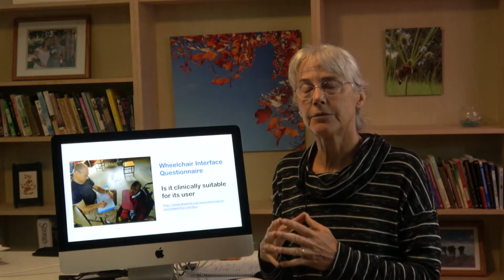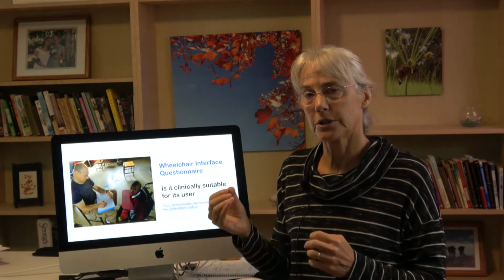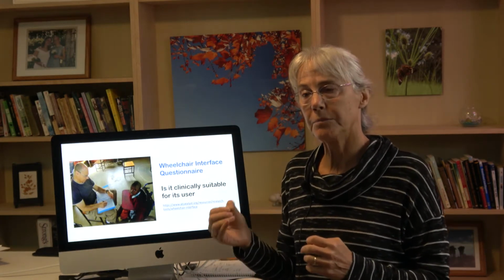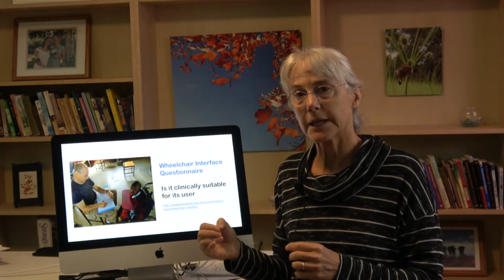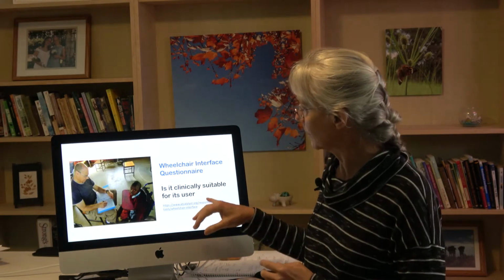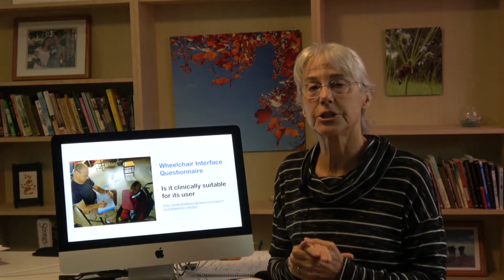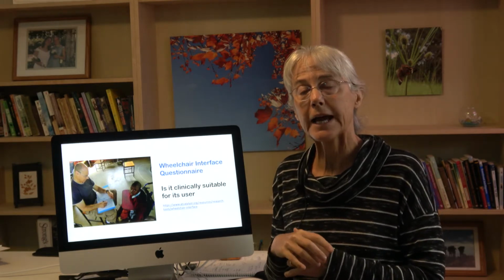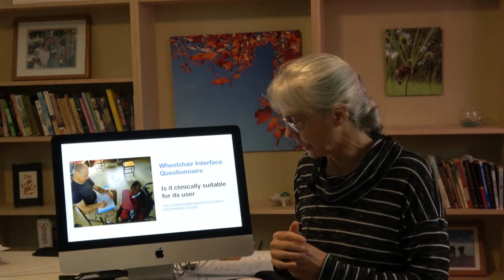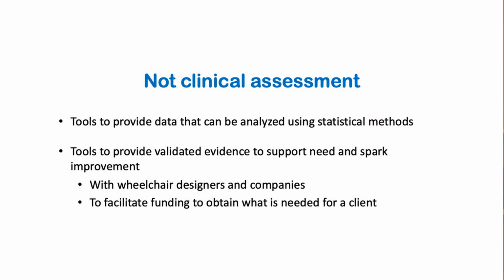It's intended for wheelchair professionals to complete. Ideally, it would be a therapist with wheelchair experience and training. It's available for download online in English and in Spanish at the www.atcatalyst.org website under resources.